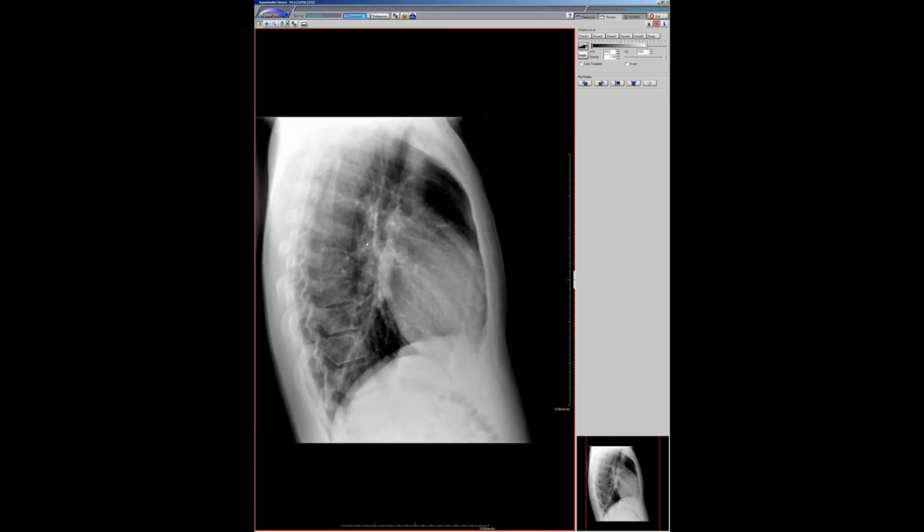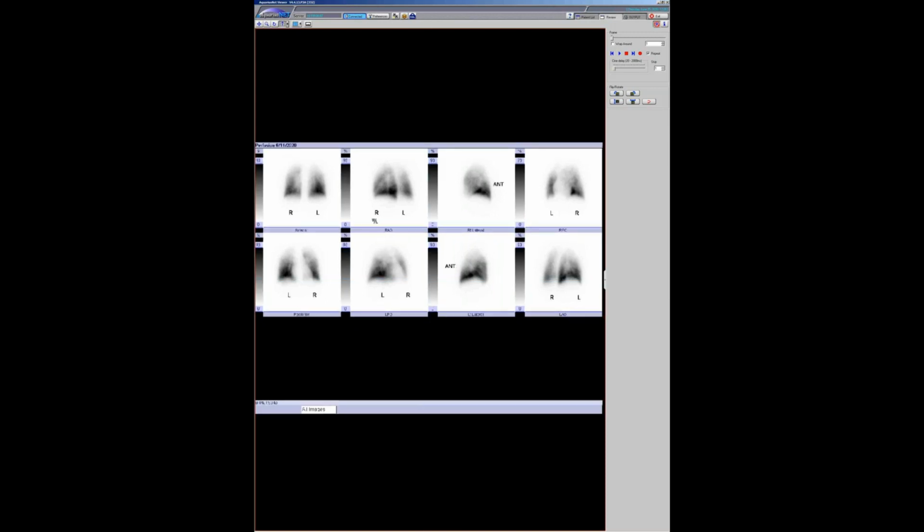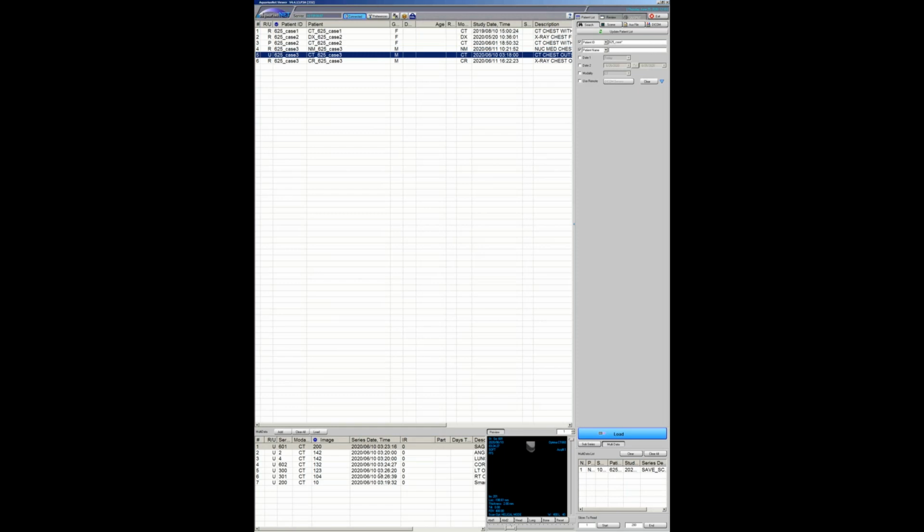But his PA doesn't look that big, but I can tell you he has very severe pulmonary hypertension. He was coming here for a potential endarterectomy, and you can see his VQ scan actually doesn't show much. Some kind of hazy hypoperfusion at the apices, but nothing that looks like a defect that would be secondary to pulmonary embolus. And here is a CT.